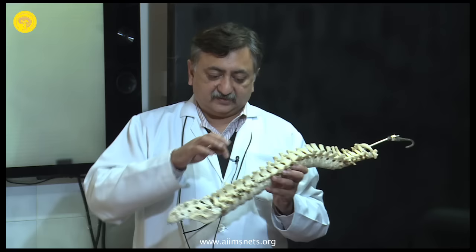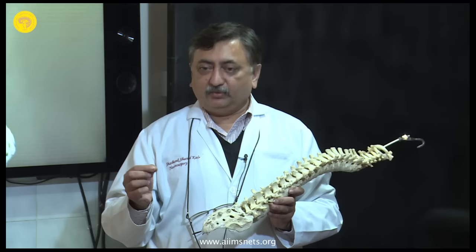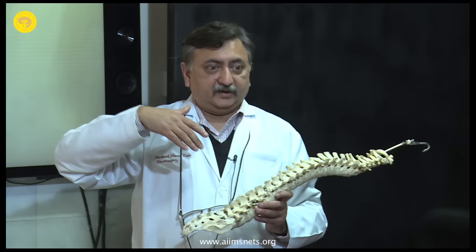Third thing you must do is, once you have made your hole, you must take a sound. There is a small thin instrument with a round ball like a dissector. It's called a sound. You put it in the hole and you actually palpate all around that your bone is intact all around, that you are in the pedicle and you have not breached the wall of the pedicle anywhere, either medially or laterally, superiorly or inferiorly.